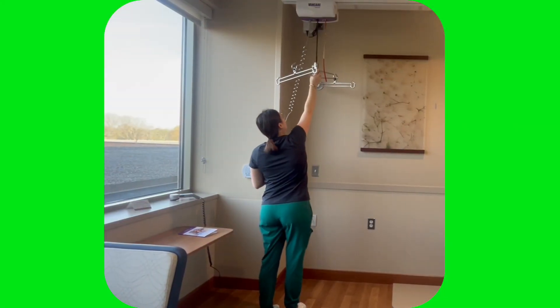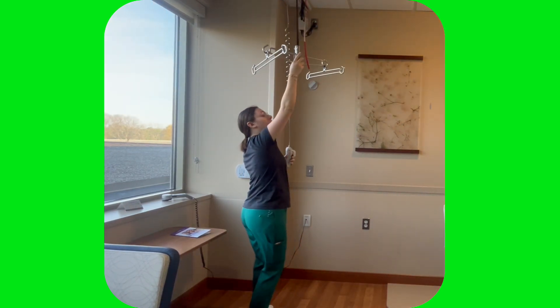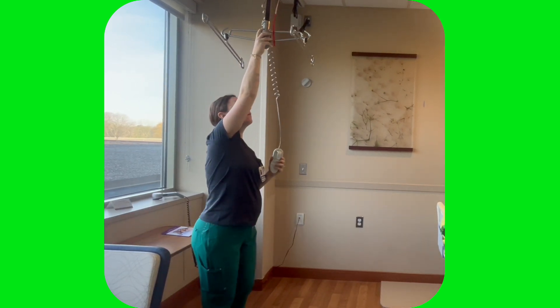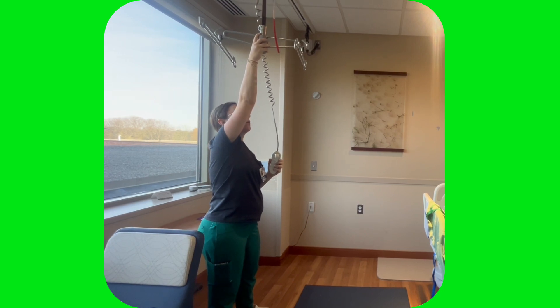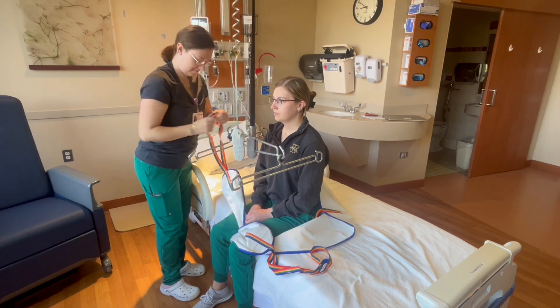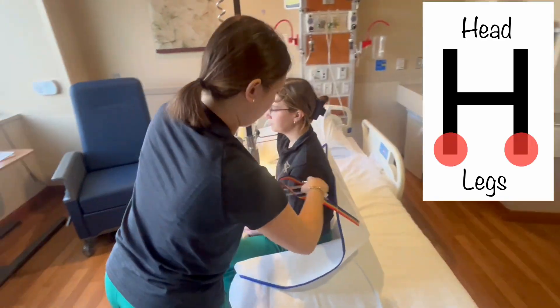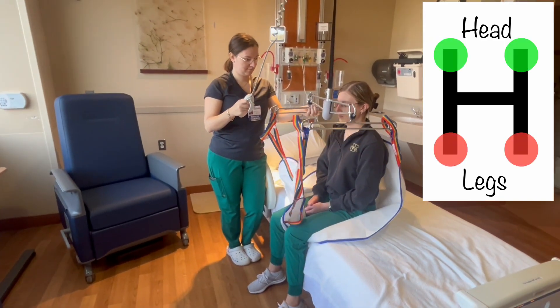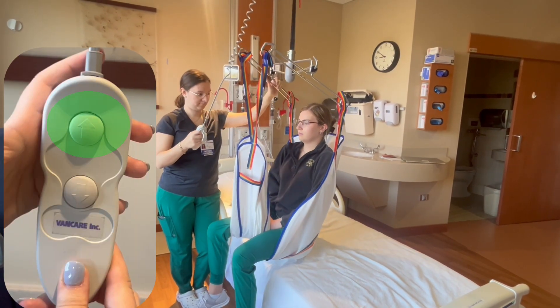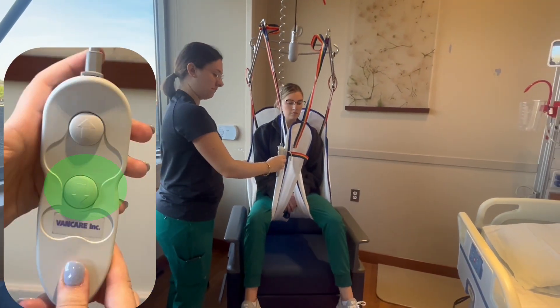With the sling positioned, bring the lift to the patient by pulling it off the charger and swinging it on the track until it's over the patient. Pull it by the H bracket and not the control unit — if you pull the control unit too hard, it will unplug and you'll need to climb up to plug it back in. Lower the bracket until you can easily attach the loops. The leg loops attach to the two corners in the front and the head loops to the back corners. Ensure that you are matching the loop color for both legs and for the head, but the color for the legs and the head do not need to match each other. With the sling attached, push the up button and lift the patient until they clear the bed, then freely move them anywhere the track covers to transfer them to another surface.